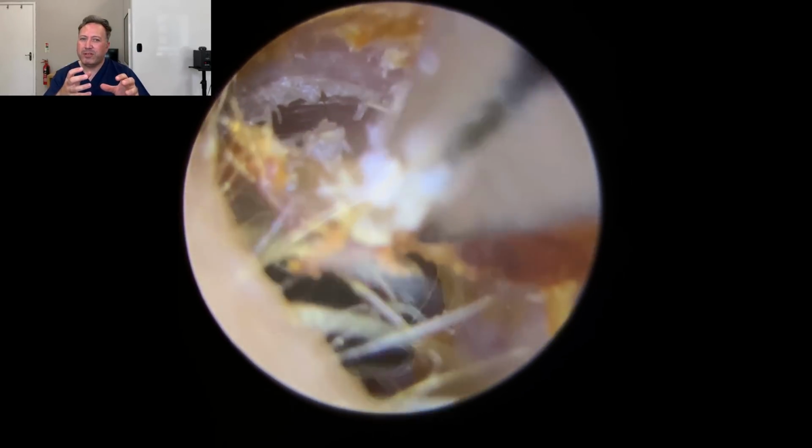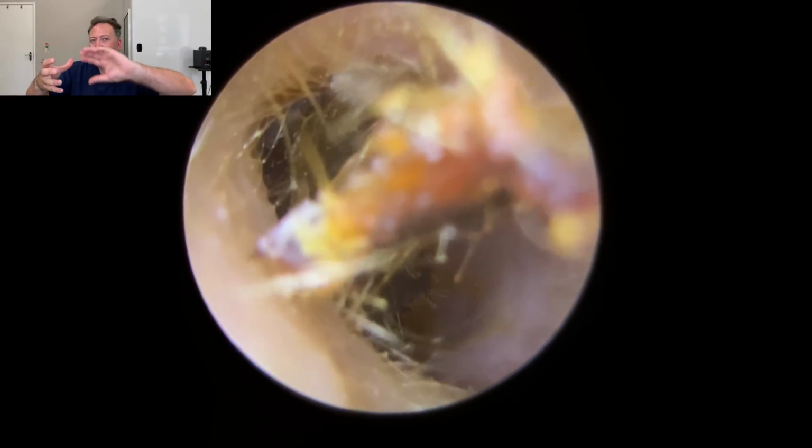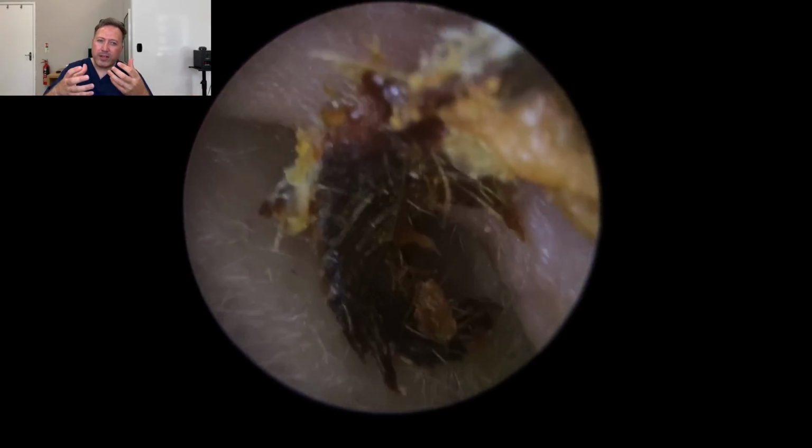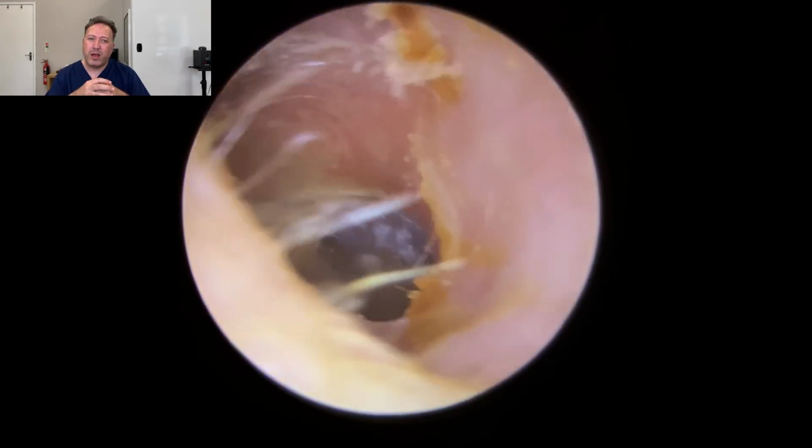So as we pull this down now, you'll see it just peeling away from the left side, that rear section, the side closest to the eardrum, coming away nicely now. There we are. You can actually see the loop, the curve of it there as we take it out of the ear canal as well. One dry, hard piece.